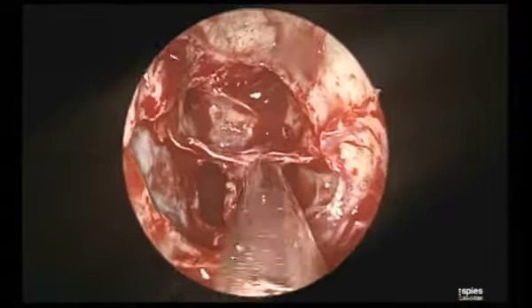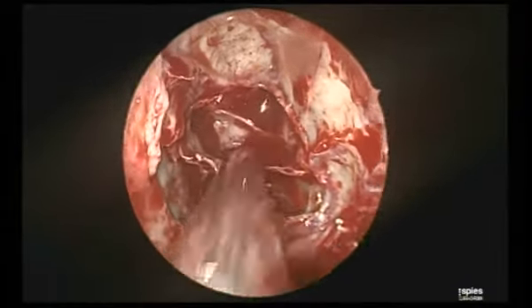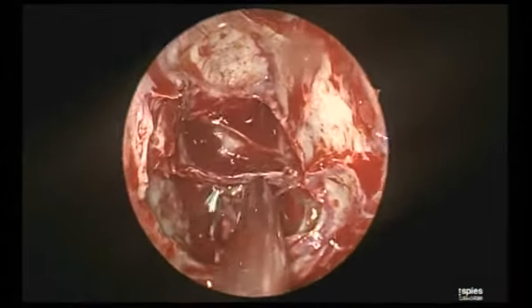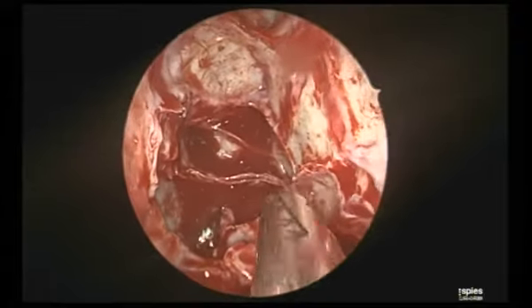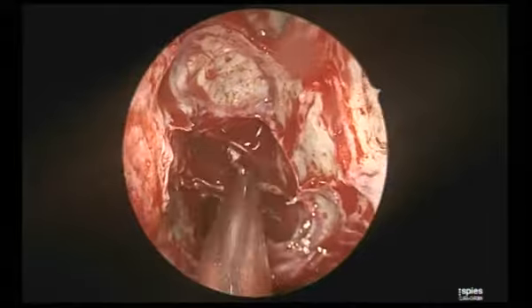See, what I am trying to ensure is limiting myself anterior to the sphenoid sinus ostium. So totally, as long as I am anterior to the sphenoid sinus, I am 1000% safe. In any given situation, the optic nerve and carotid cannot come anterior to the sphenoid sinus ostium.